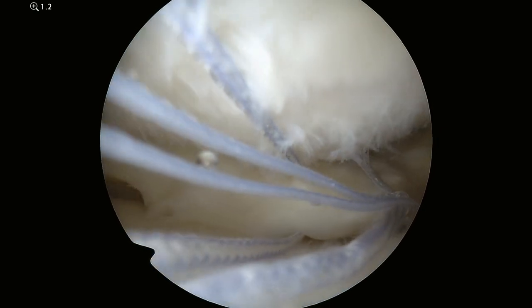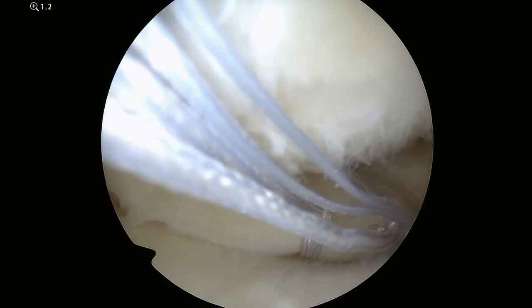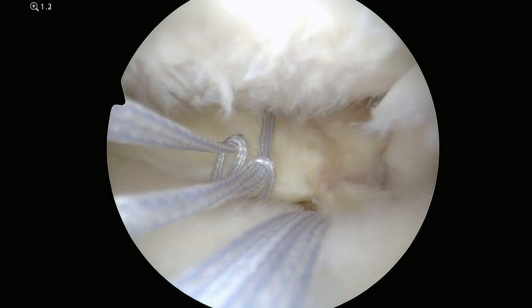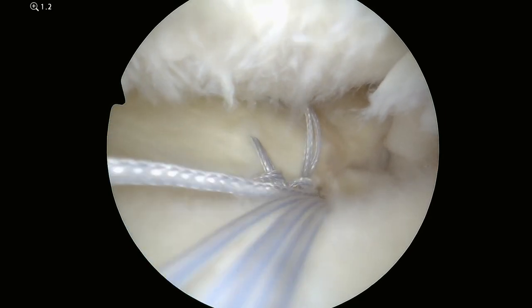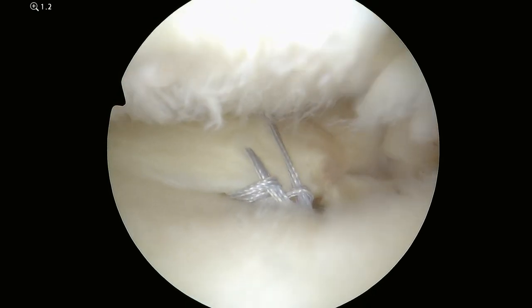Now I'll take the tails of the two stitches that I've already passed and feed them through the bone tunnel that was drilled prior to the video recording starting, and pulling it down. This will pull the back end of the meniscus and reattach it back to the bone, allowing it to adequately absorb shock while you're walking.